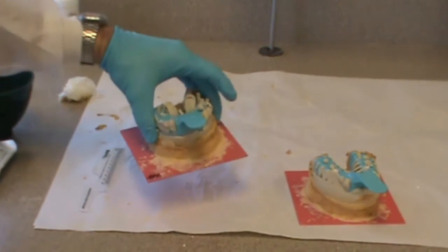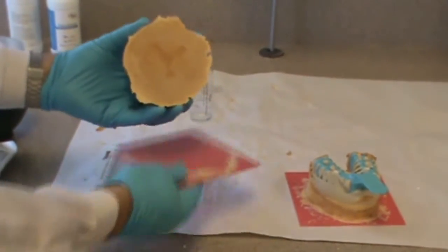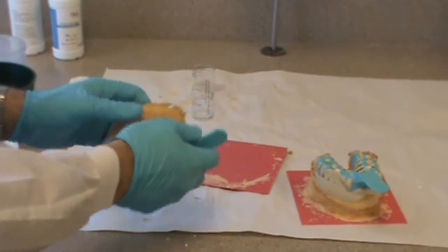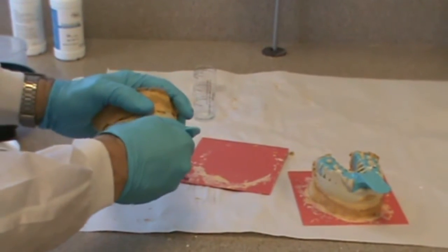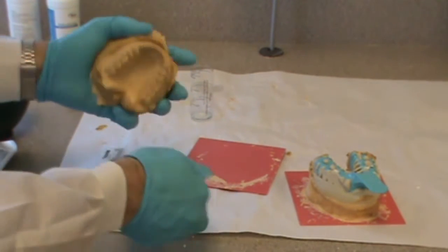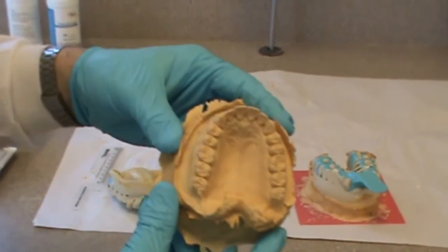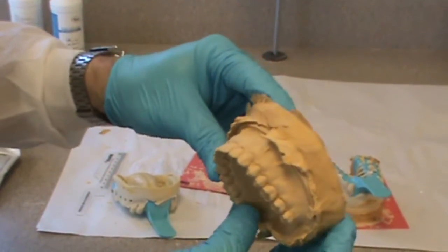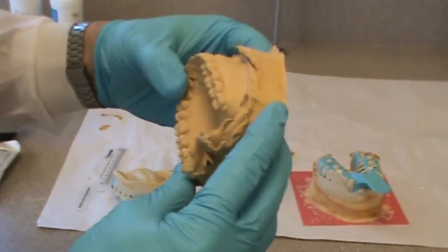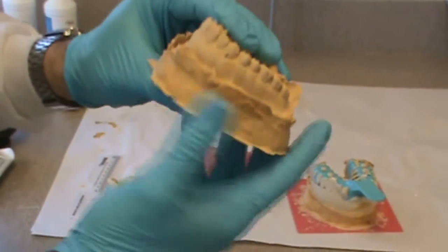Now that our bases are completely set, we're going to remove our casts from the impressions and see how our pour-up looks. It should come out relatively easily, and you can see how the stone is completely covering all the anatomy, even beyond the anatomy that we captured in our impression — that's kind of what we want to see.